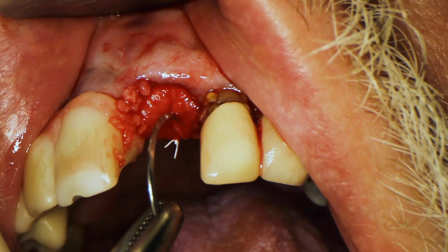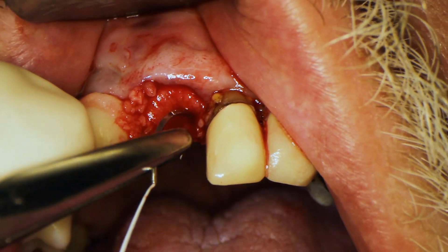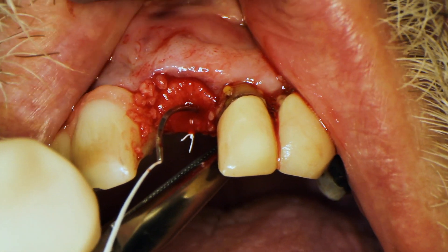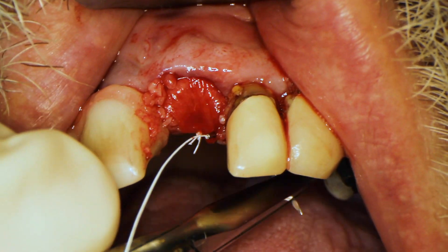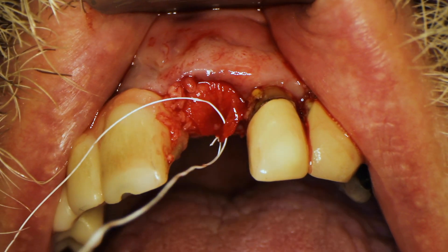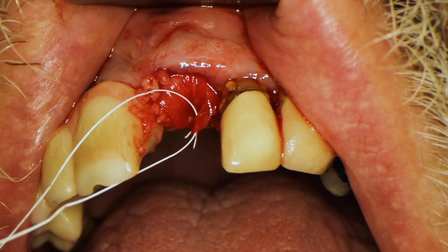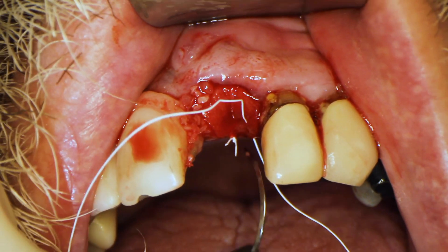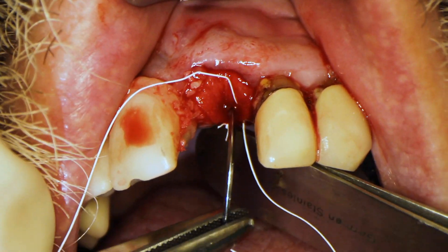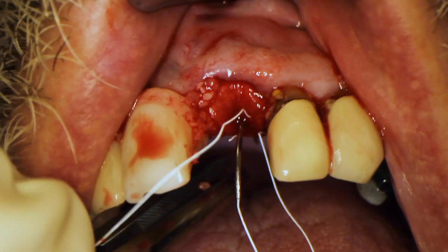Now I'm grabbing one more portion of the membrane — just the corner on the lingual side — to tack it down. This part can sometimes dislodge your membrane, so you have to be careful. You've already got it pinned down on the facial and now the lingual. I'm tucking in that corner and pinning it down too, passing through the membrane then through the lingual tissue to really secure it in place.